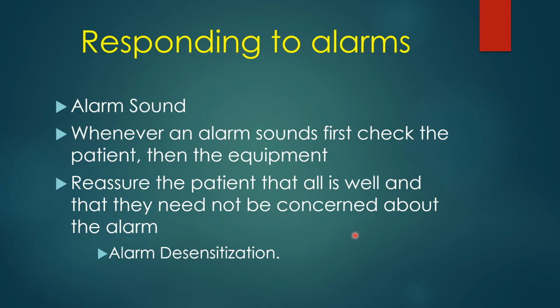So one thing that you can do to help is avoid what we call nuisance alarms. When we suction our patient, we know the alarms are going to go off. So before you suction, push the alarm silent. You get 2 minutes of alarm silence. The alarms are going to be going off, he's going to be coughing and all this kind of stuff, so try to avoid nuisance alarms.